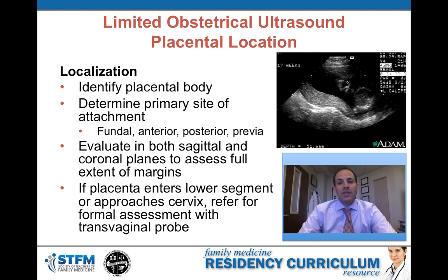Here's an example of a posterior placenta, which is deep in the deep part of the uterus. So if your ultrasound probe is here, this is the most deep wall of the uterus, and the placenta is attached here. This is a posterior placenta.